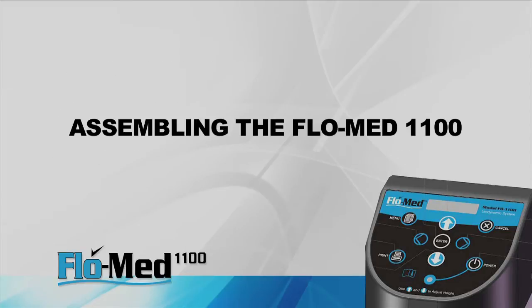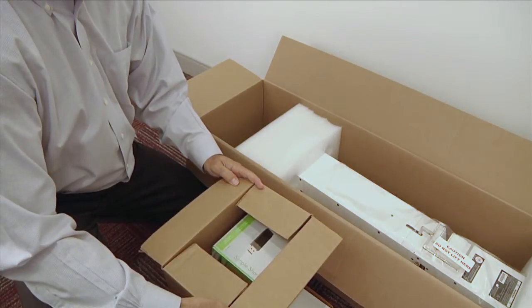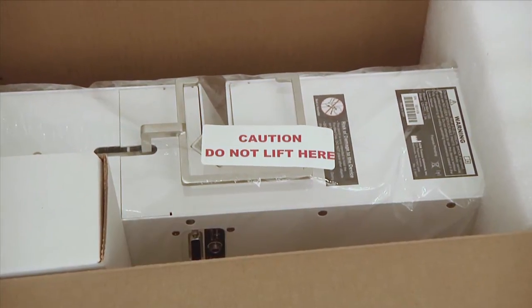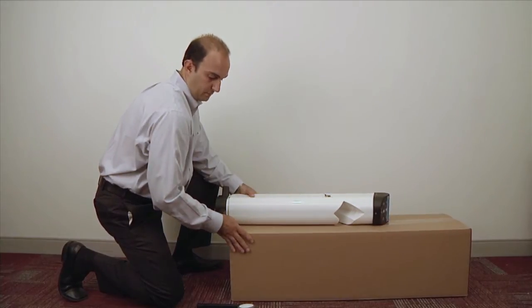Assembly is quick and easy with the FlowMed 1100. All that is required is the assembly of the legs. Remove contents from the box — this includes two smaller boxes and the FlowMed unit. Caution: be careful not to damage the cup perch while lifting the unit out of the box, as this is the sensitive part of the unit assembly and should not be jostled or used as a handle. Position the FlowMed base unit on a raised, level working surface as shown, and be careful not to scratch the paint.